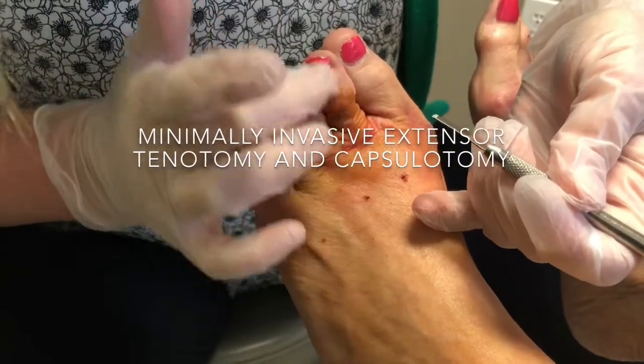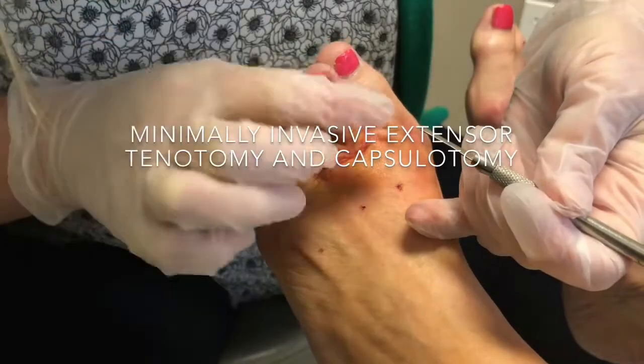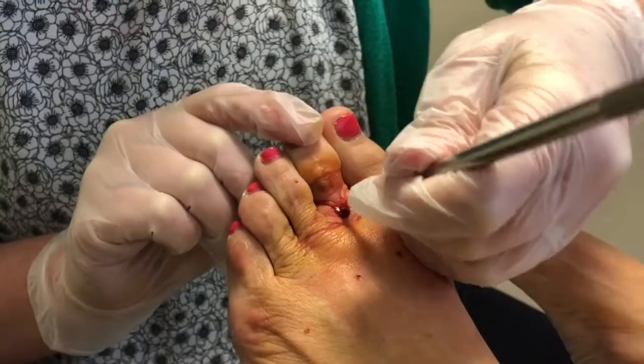Here is the top of the second digit. You can see that this toe really wants to sit up like this. I can push it down, but with pressure it'll pop right back up.